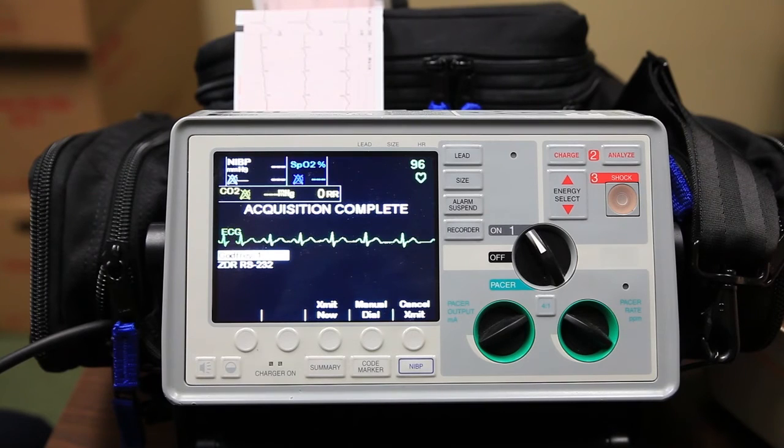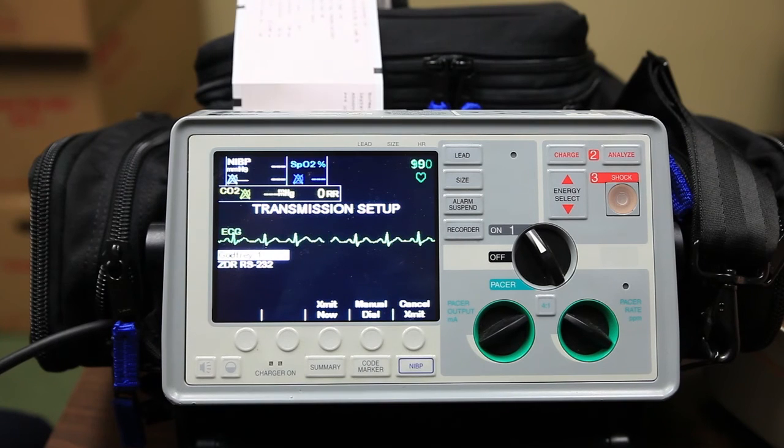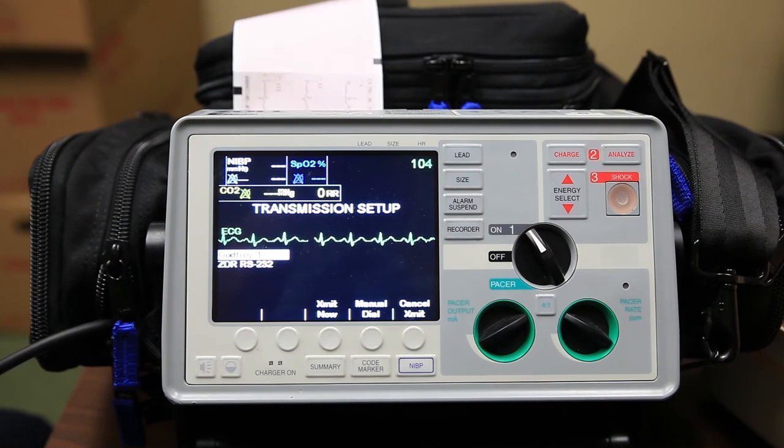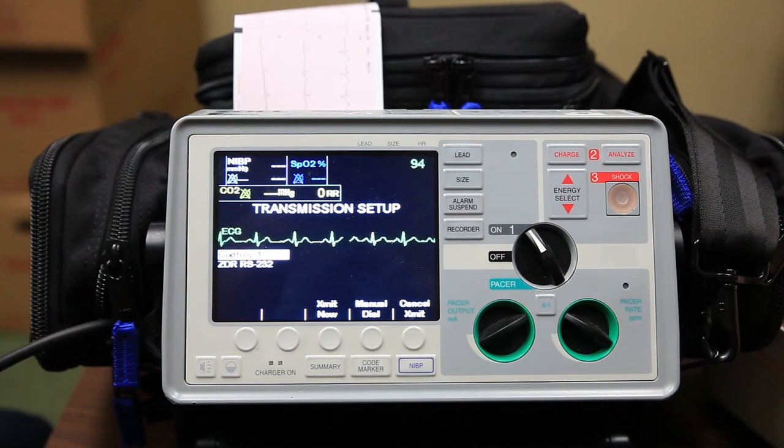Two copies of the 12-lead are going to print out. One will be kept for Godfrey records; the other is given to the transporting ambulance. You can see two strips are printing out now. When we document this on our patient care report in the narrative, we'll state that we've obtained a 12-lead, given a copy to the transport ambulance, and we can reference the attached 12-lead to our patient care report.